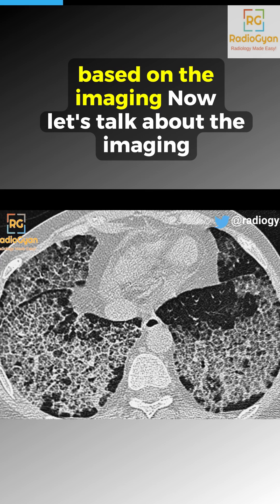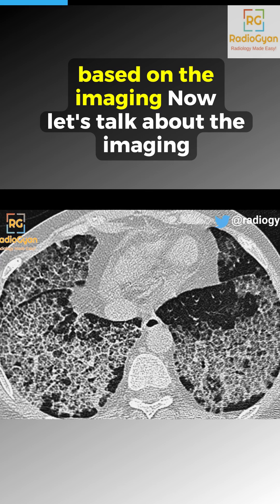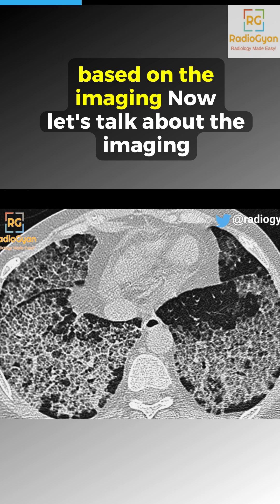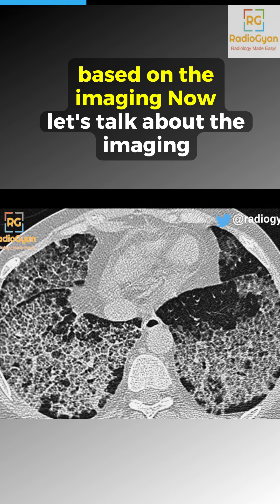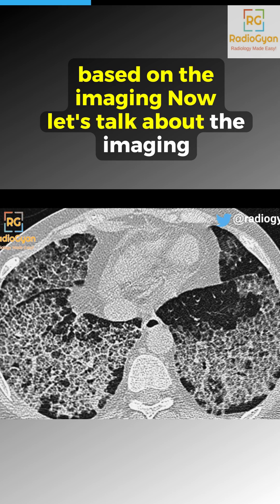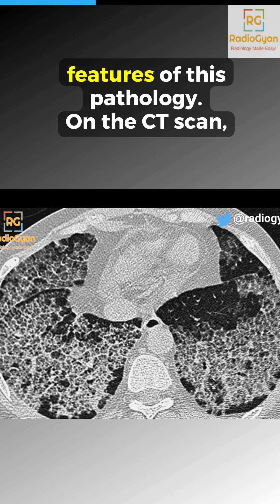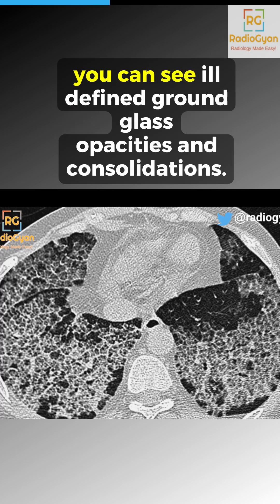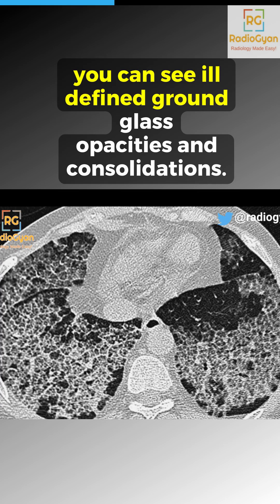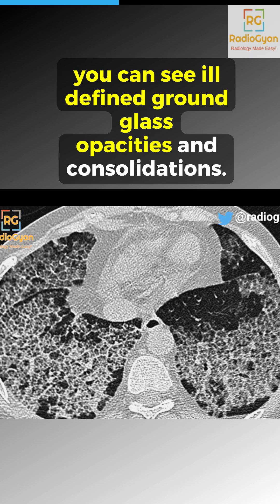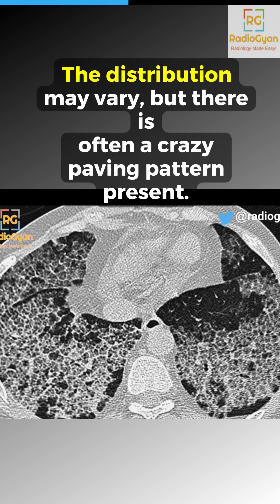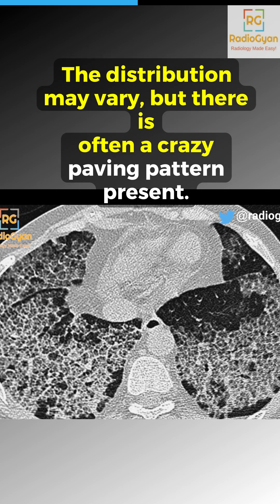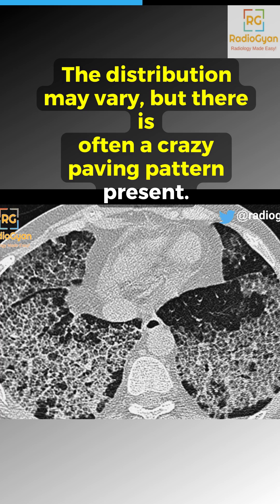Here's a hint: the CT scan shows a characteristic pattern called crazy paving. Now, let's talk about the imaging features of this pathology. On the CT scan, you can see ill-defined ground glass opacities and consolidations. The distribution may vary, but there is often a crazy paving pattern present.